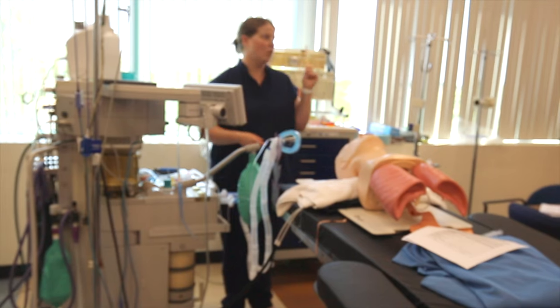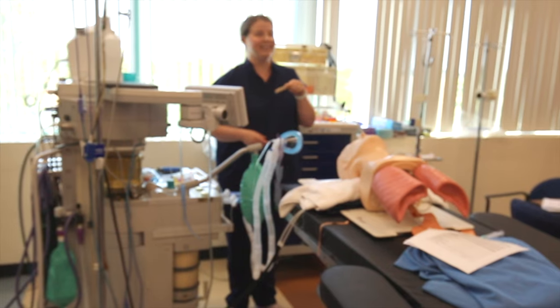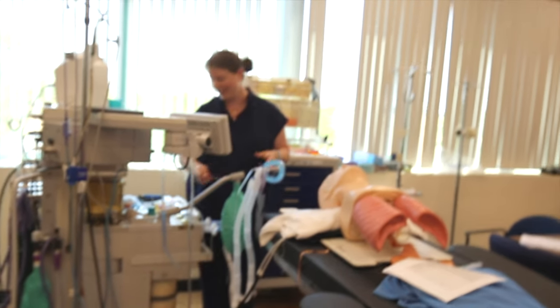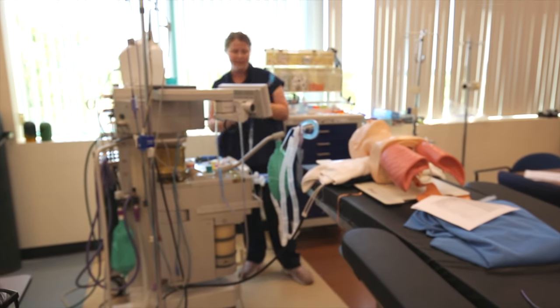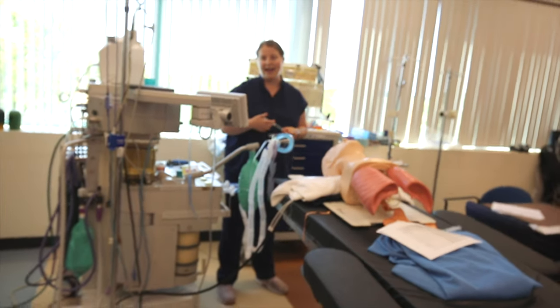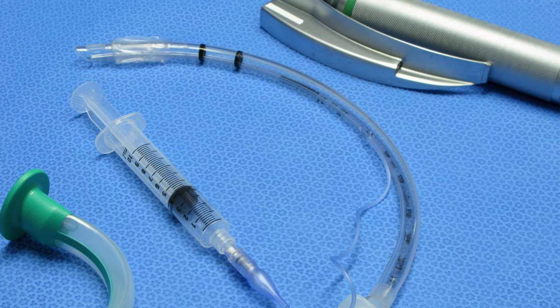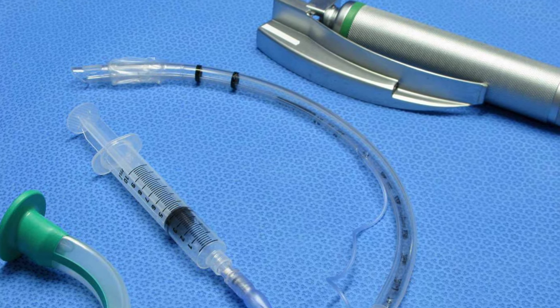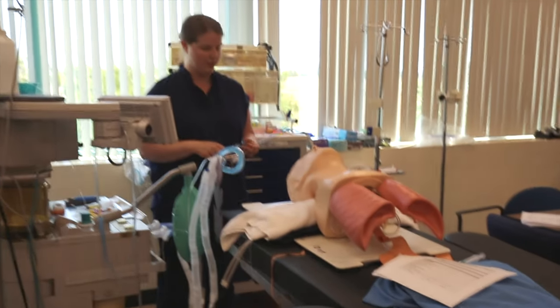Tongue blade for OPA insertion. I actually used the tongue blade to get the VL in yesterday. I had to. There was no way to get it in. Airway, ET tube. You have an ET tube appropriately sized for your patient. Generally men, 7.5, or 8 if you know they're going to go to the ICU long term. Generally women are a 7, sizing up for much larger women or, again, long term ICU expectations.